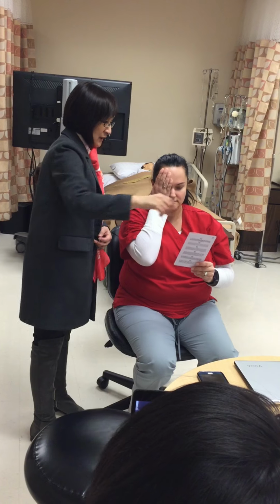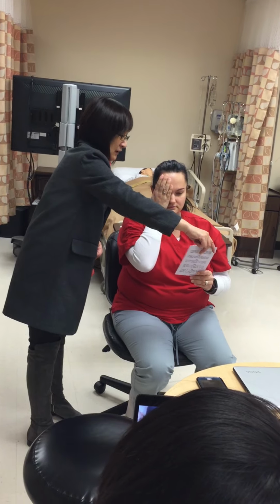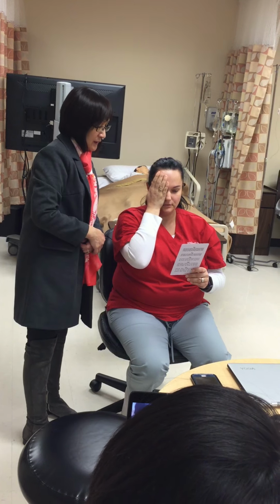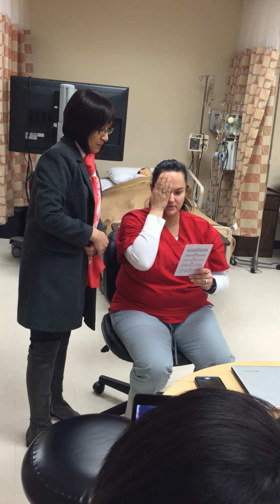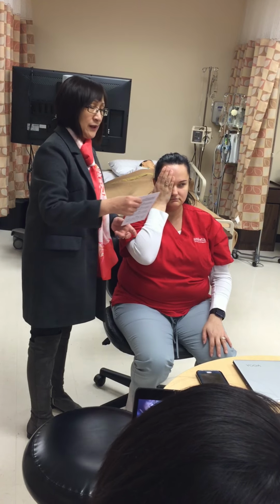Again, hold it. Can you read number 7? Yes. Flip it. Which number can you read clearly? Number 1. In the second century of the Christian era, the Empire of Rome comprehended the fairest. So here's the thing.